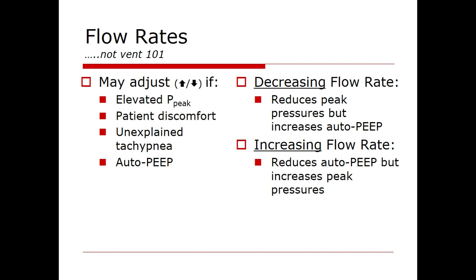Think about why you would be doing it: to make the peak pressure alarm stop. And sometimes patients are more comfortable on the ramp wave. But be aware of the potential consequence of it in terms of auto-PEEP. So specifically, I'd worry about using a ramp wave in somebody who's prone to auto-PEEP, which is largely patients with asthma and emphysema.